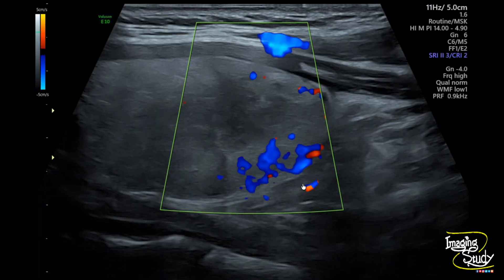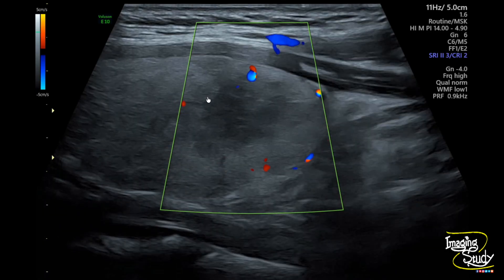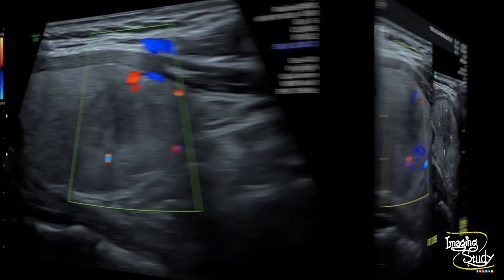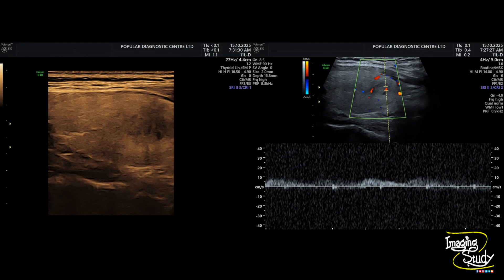Here's again a longitudinal section with color Doppler and you can see only peripheral flow. The approximate measurement of this ill-defined area is around 1.5 cm. On color Doppler, you can only see some peripheral flow. Here's the pulse wave Doppler sample taken from the peripheral flow of the hypoechoic area.